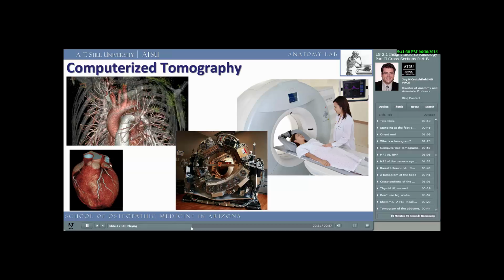Nevertheless, as she moves into the scanner, the X-ray detectors are spinning around her. The radiation sources lie across from the digital radiation detectors. Think of it as digital film that will sample each image. The computer reconstructs each image, creating multiple tomograms, hence computerized axial tomography. Taking the cover off the CT scanner shows you the spinning set of digital radiation sources and detectors. Looking at the middle photo, the graphic detail in 3D images is indeed stunning.